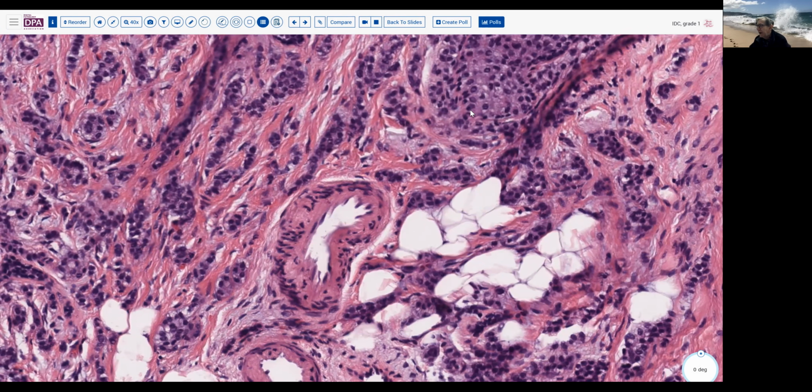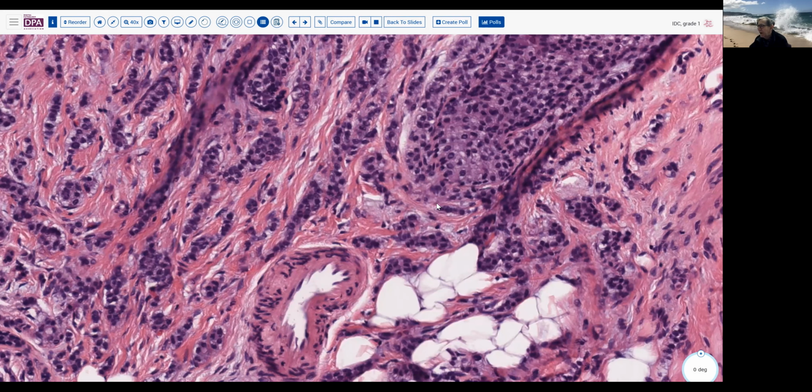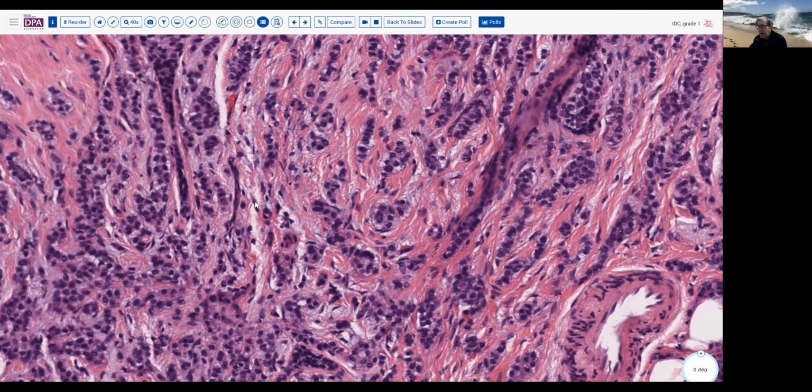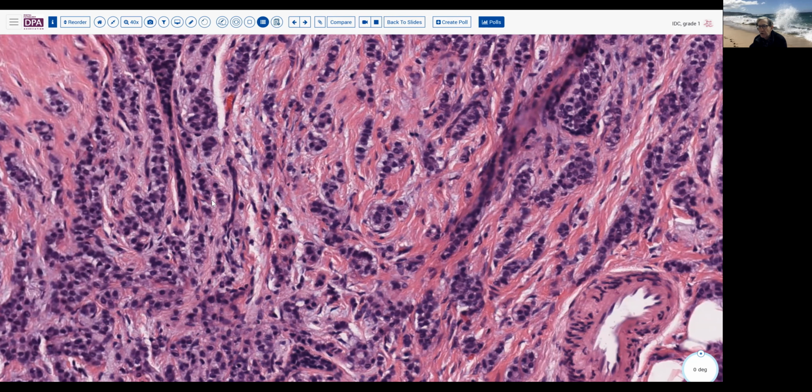But under your own microscope with a 40x lens, you should be able to look at 10 fields and determine whether or not you have reached your threshold for a score 1 or score 2. This, in our hands, scored as a score 1. And so for mitoses, so was a 3 for architecture, a 1 for nucleus, and a 1 for mitotic score, thus a grade 1 tumor.